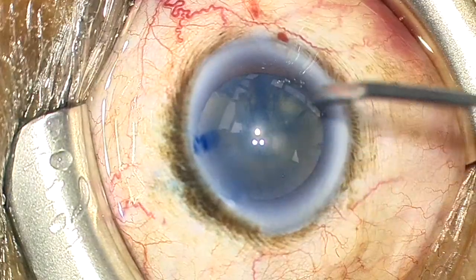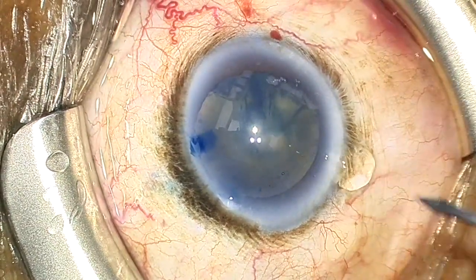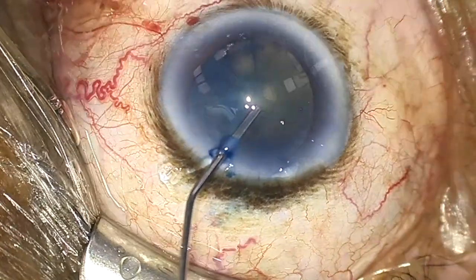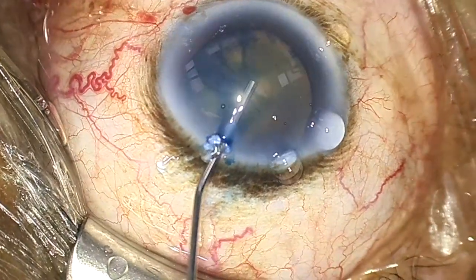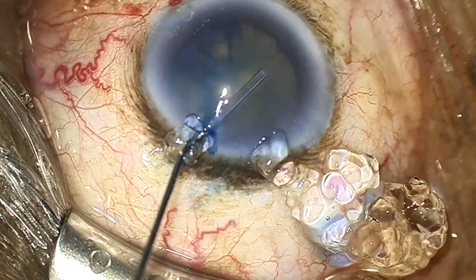Unfortunately, at this point a Descemet's detachment was noted inferotemporally, so several stab incisions were made into the area of the Descemet's detachment to help the helon vent out. Since Healon 5 is heavier than helon, the AC was hyperfilled with Healon 5 to help push out the helon that was trapped at the interface and flatten out the Descemet's detachment.